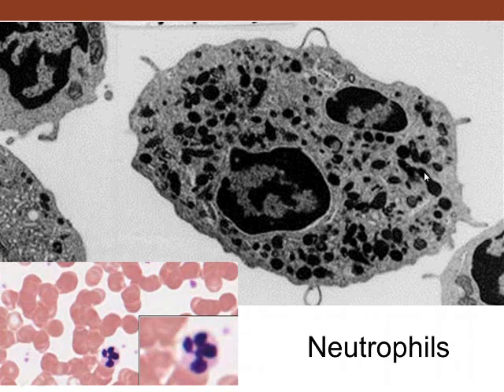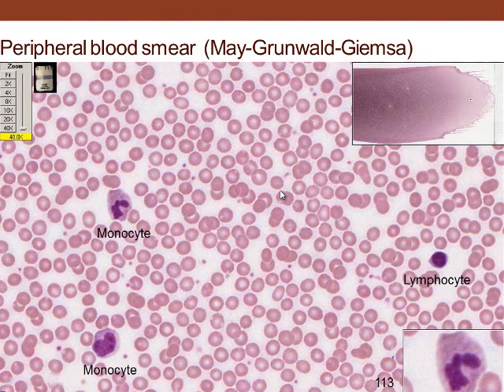These are small granules. These are mitochondria. So the granules are smaller than the mitochondria themselves, and so we can't see distinct granules, but you see a lobulated nucleus. This is part of the nucleus, part of the nucleus, part of the nucleus. It's all one nucleus, but it's got different lobes to it.